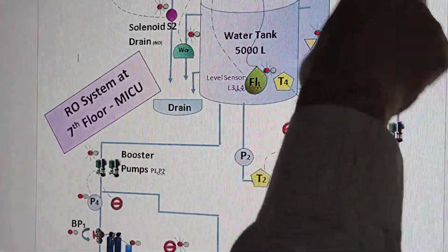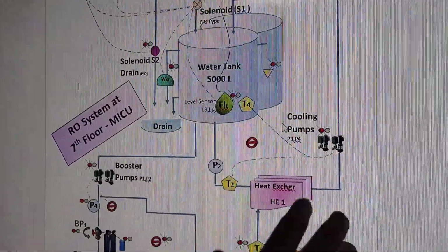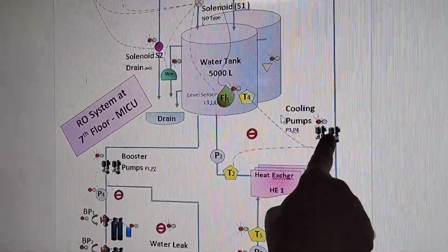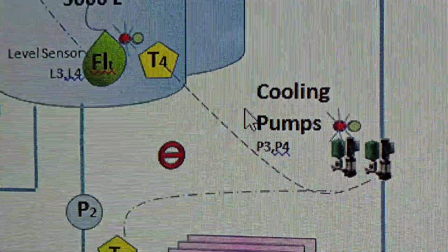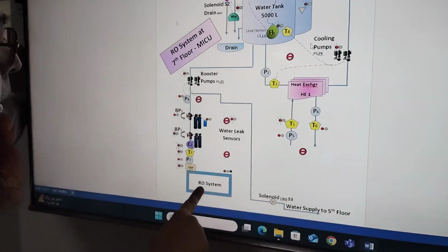And then it will keep on circulating the water till the tank temperature is reached. Once the temperature is reached, these pumps will be off. Okay, and then the next line is another line which is going to the RO system for the 7th floor, for the ICU, medical ICU.